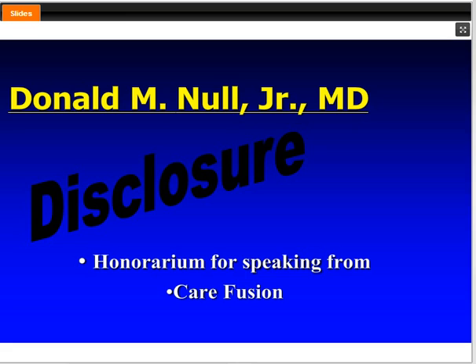And this slide sort of demonstrates where you are with IMV ventilation, jet ventilators, flow interrupters, and an oscillator can actually go to 20 hertz, although that is not a speed with which we would typically use it. Typically 15 hertz or 900 breaths per minute would be the maximum that we would use. If you look at this slide, this is how gas is exchanged.